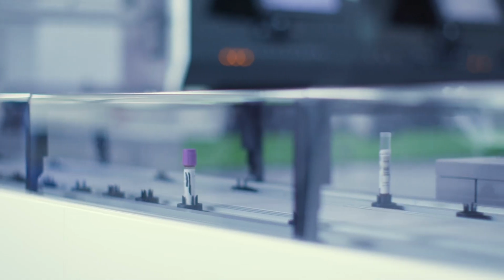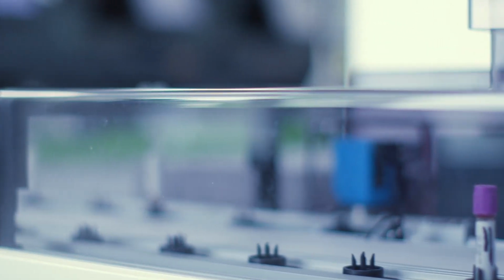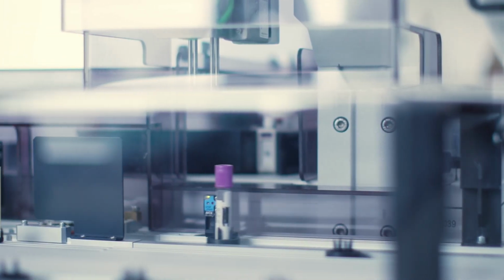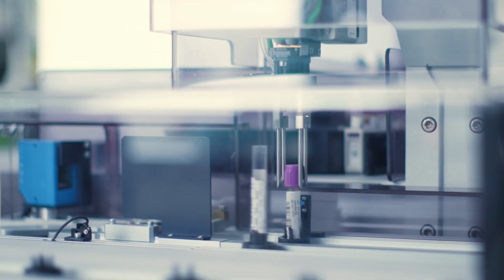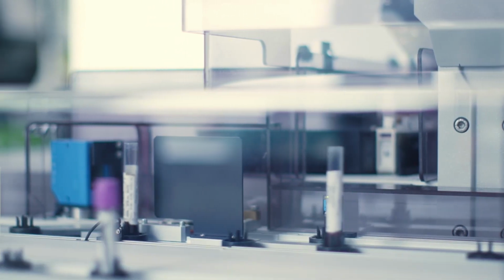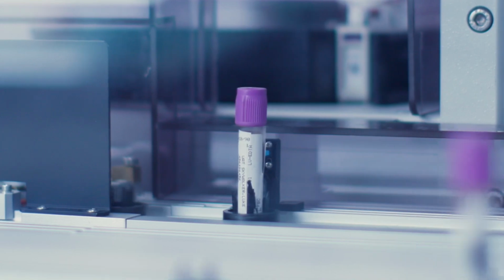So currently we're performing about 1,300 full blood counts a day and about 250 coagulation samples. Obviously, being the hub site at Charing Cross, we have a track solution, so in the future the amount of work we're going to be receiving is going to significantly increase, potentially 2-3 times the volume will be processed on the analysers.